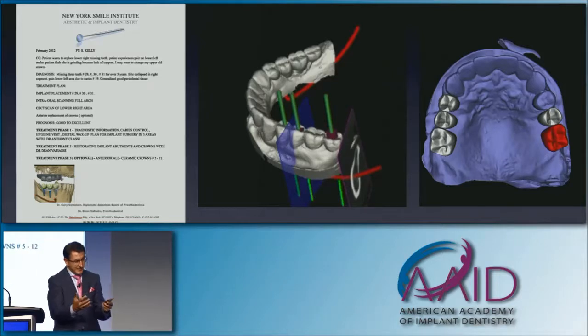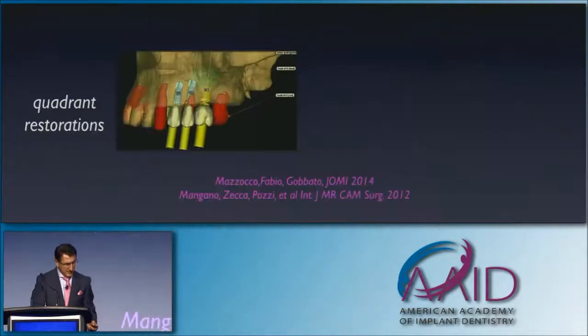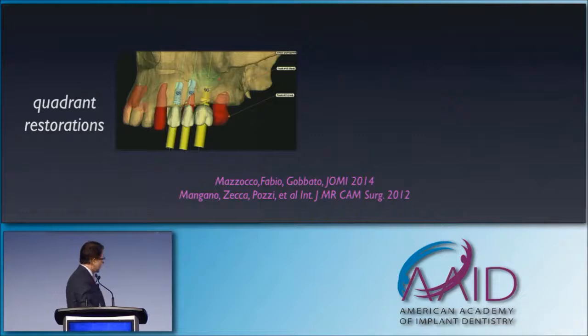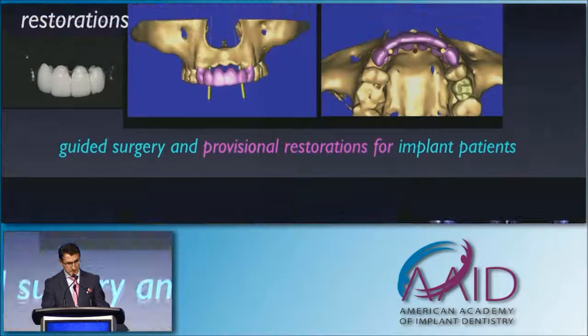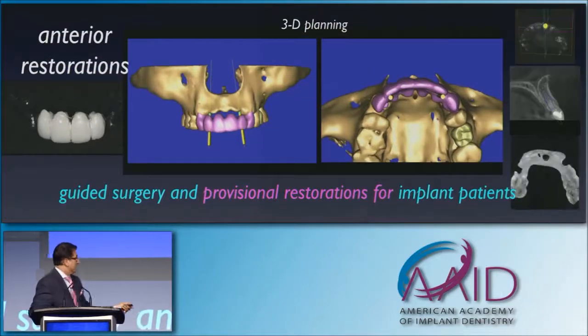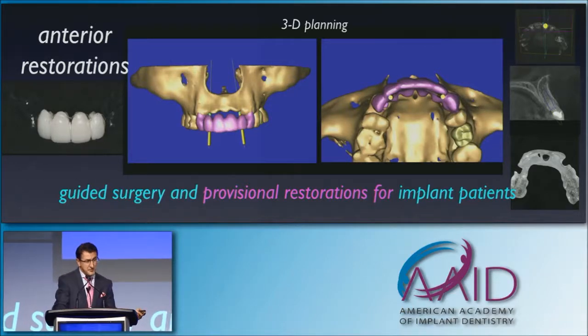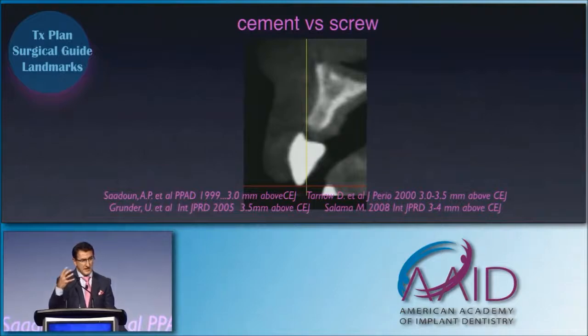So I think presenting it that way is very different than whatever smart things that we can possibly say to them. Again, photos like this where we can show them about implants and sinus lifts and what it all means and give them some statistics about it so they can make some logical decisions. Things like this where we scan a patient who wants implants today, and she realizes after we look at the scan, there is no bone there. Maybe replacing the bridge may be a better option for her. So again, visually for me, it's easier to talk to the patients with the actual models of themselves than try to just kind of give them information without some visual.